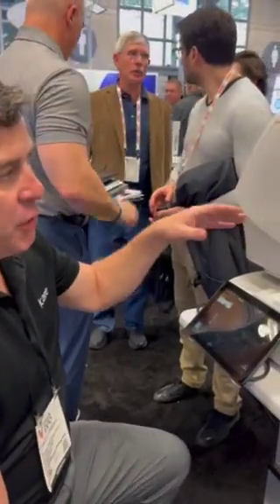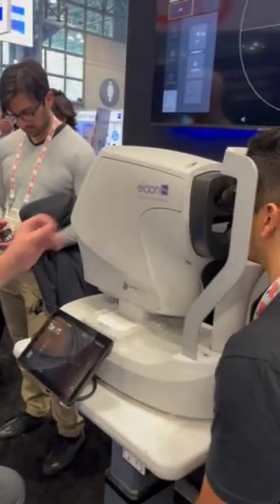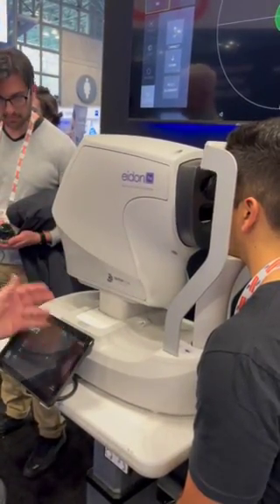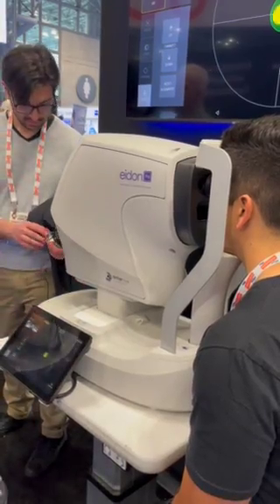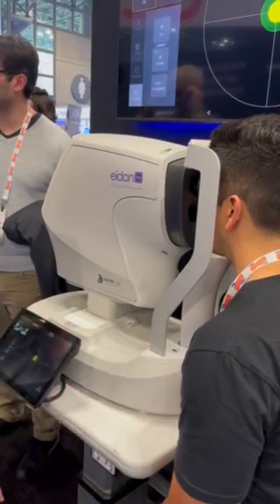So again, we're going to take three images. The system is fully automatic — it's going to find the eye, align, focus, and take a picture. So if you look straight ahead at the green light, and when you hear the beat, just keep your eyes wide open.